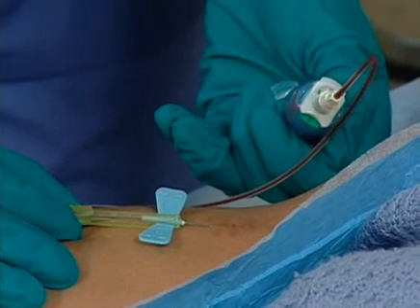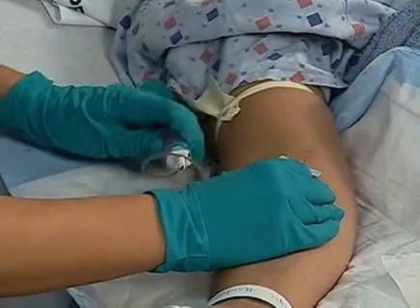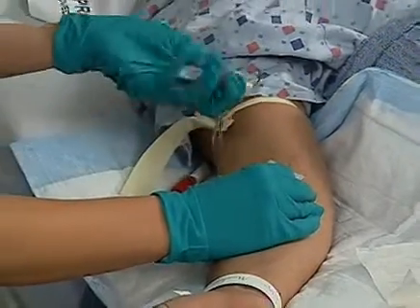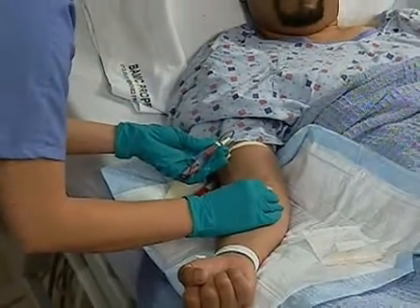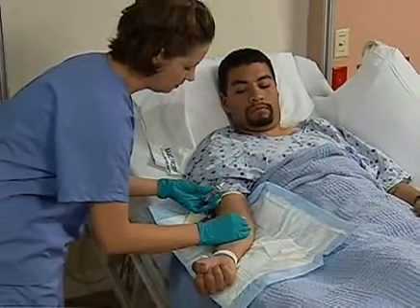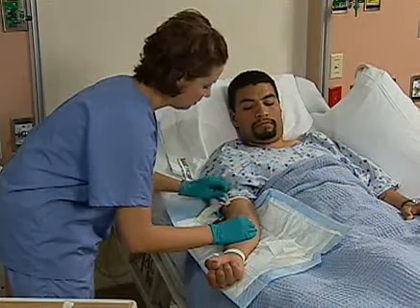When blood is no longer flowing into the blood tube, remove the tube from the vacutainer holder and insert the next tube. Repeat until all the tubes of blood have been filled. Release the tourniquet.